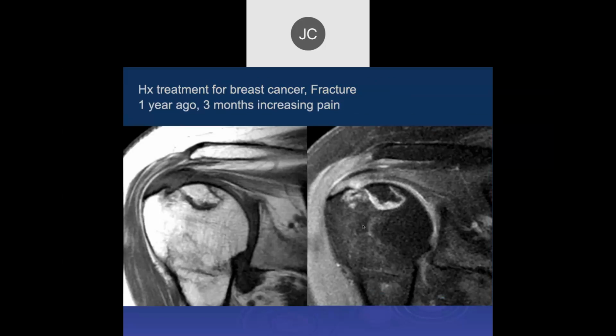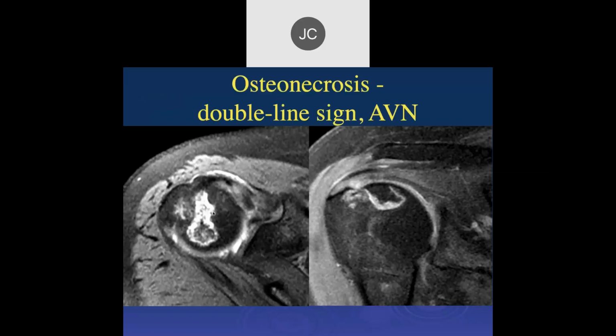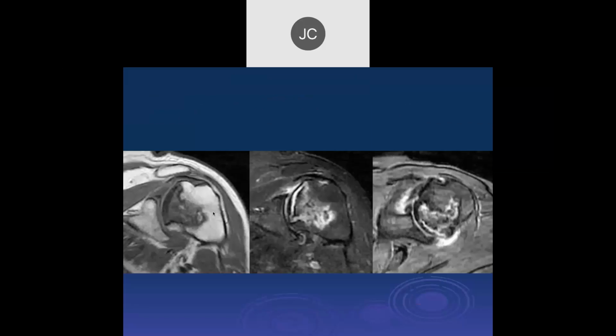So we have a history of treatment for breast cancer, fracture 1 year ago, 3 months of increasing pain, and there's that serpentine increased signal on the PD FATSAT images. So again, I'd be concerned for an AVN. Another post-traumatic AVN. Here, humeral head, middle PD FATSAT image, we see the double line sign concerning for AVN. So this is another osteonecrosis with secondary impaction injury and degenerative disease.